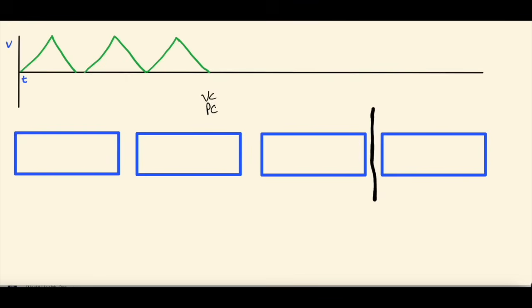So in these two different modes of ventilation, the difference in what you set is in volume control, you set a tidal volume, and in pressure control, you set an inspiratory pressure. And what this means is the thing you're not setting in that mode is the uncontrolled variable. So in volume control, you're controlling the tidal volume the patient is getting with each breath, or the cc's of oxygen that the ventilator is pushing into the lungs with each breath.